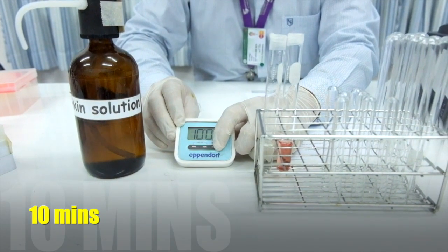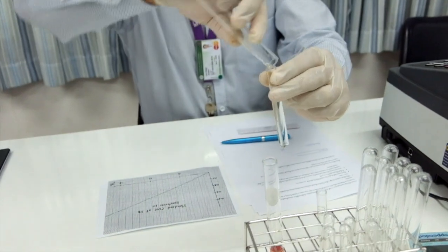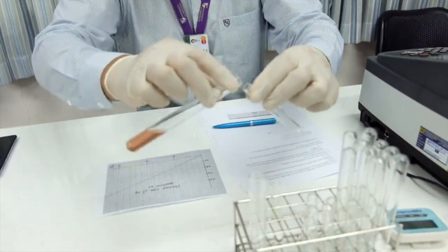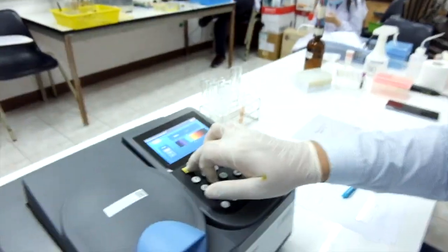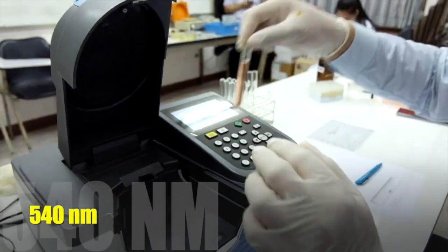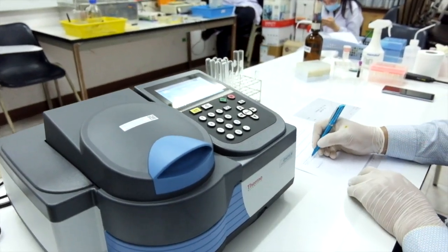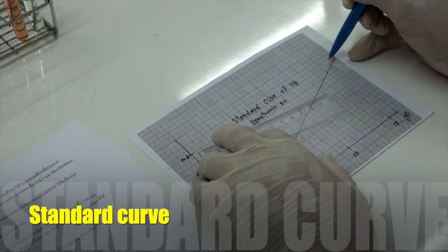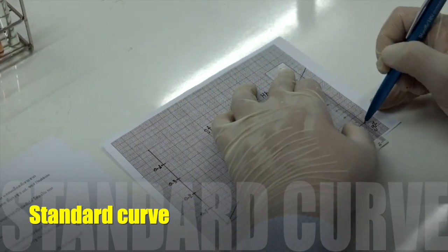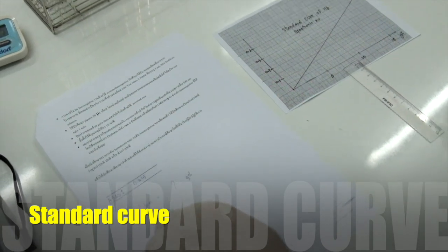Leave the tube standing at room temperature for 10 minutes. Pour the mixture into cuvettes. Determine the absorbance at 540 nanometers using pure Drabkin solution for setting 0. Record the absorbance. Deduce the level of hemoglobin from the provided standard curve and record the results.